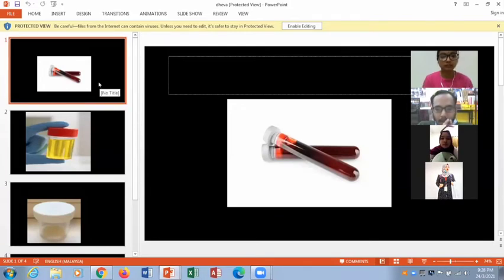Alright. Today I want to share what samples are collected in microbiology. We have blood, urine, CSF, and sputum. Now I will explain how to handle blood. The staff or nurse will clean the skin and insert a thin needle into the vein to draw the patient's blood. This will be repeated using another vein to get the most accurate result. Then the blood will be sent to the laboratory for processing.